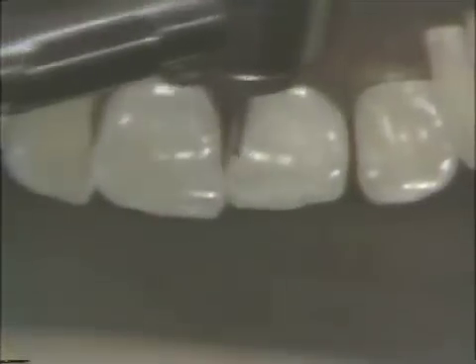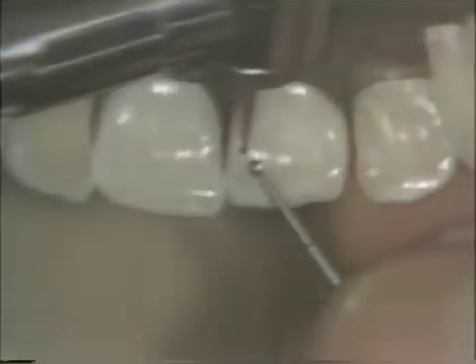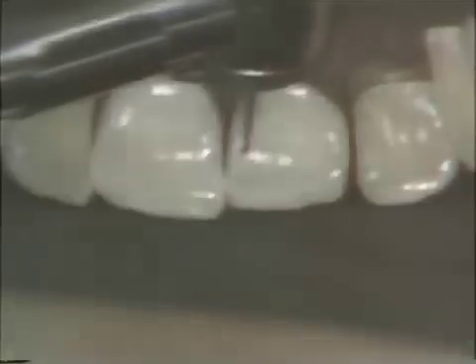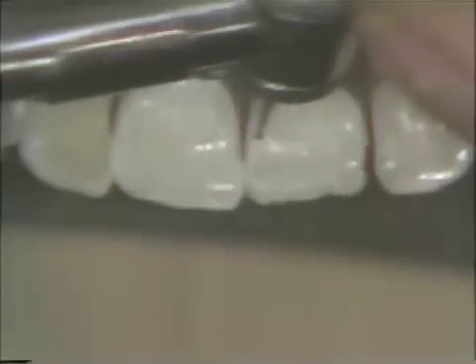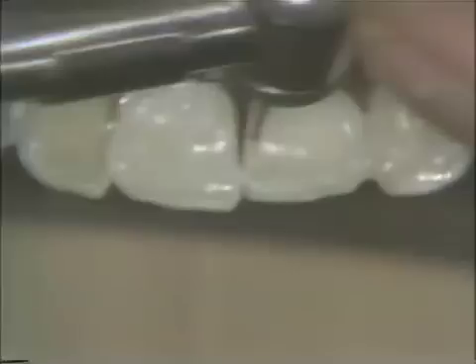We will now start with a 1/2 round burr, but before we start, I'd like to compare a number 2 burr with it. Many dentists wish to use a number 2, but look at the difference in the size. And as we look back and remember what our x-ray showed. Now, if you notice, the first penetration point is just inside the dento-enamel junction, or the marginal ridge.